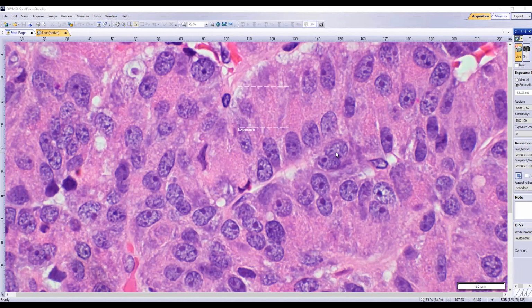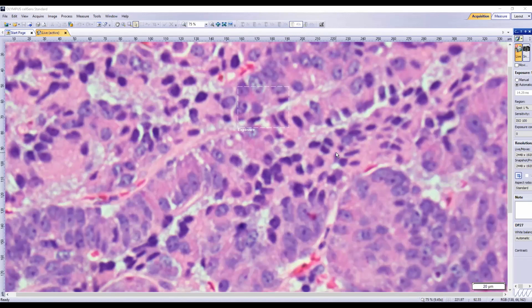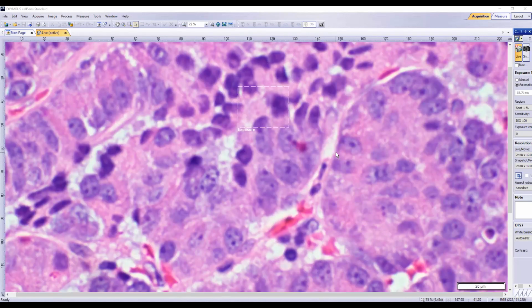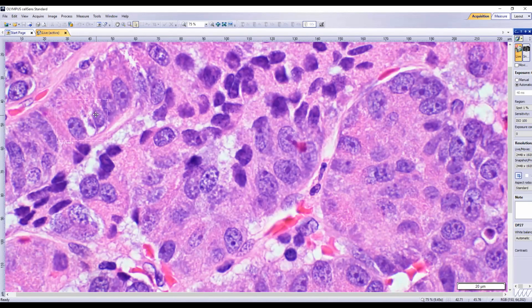In the pancreas, what tumor? Adenocarcinoma. Well, prominent nucleoli like this, what's the characteristic feature of? Is this a metastatic tumor or is it a primary? It's a primary. Acinar cells. Acinar cell carcinoma can have prominent nucleoli.